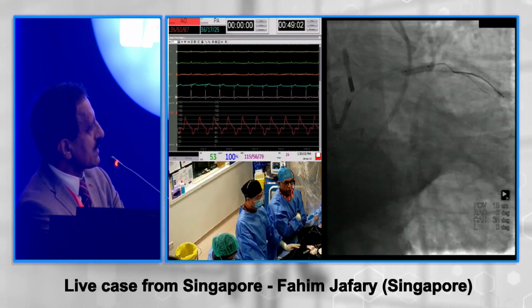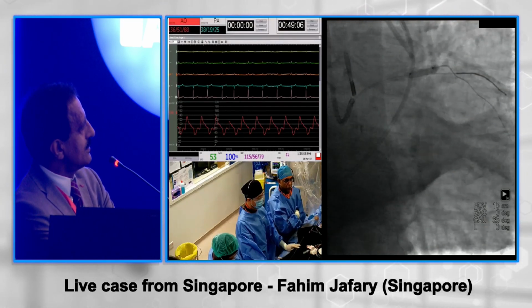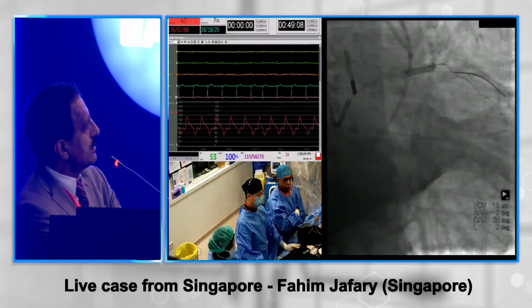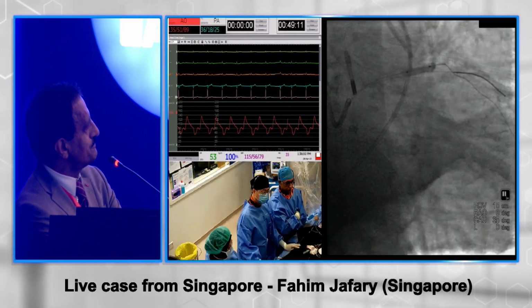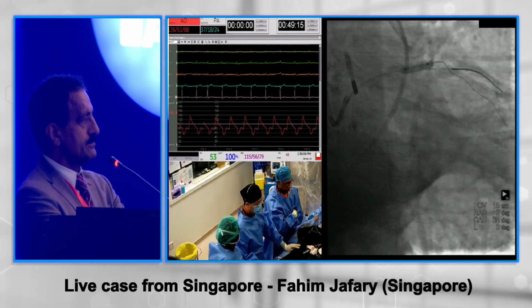We need your help and suggestions on this case, because this is an unwell gentleman and we need to be moving quick on him. Ashok, what would you do? So my clear issue is, what sort of pressures is this at?